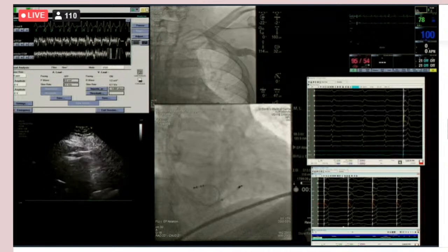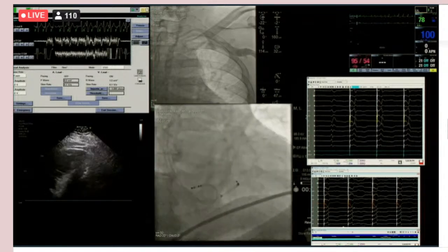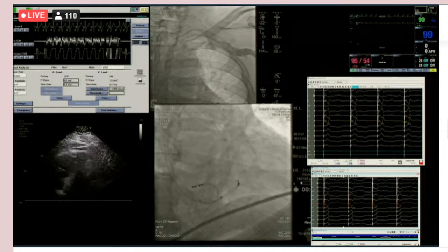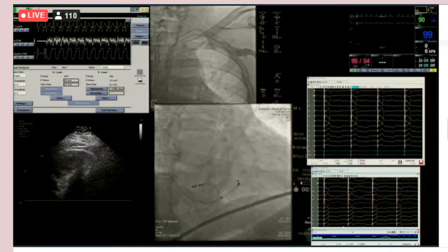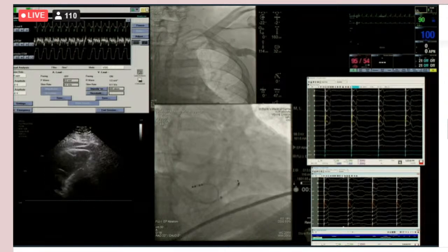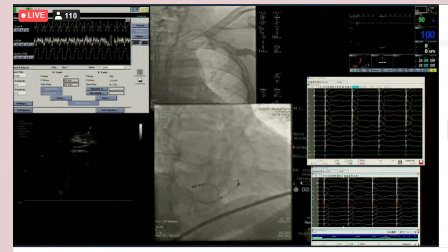Do you do that also or not really? I was planning to see how the R is bigger now. So now the Q is followed by the R, and the R is a little bit bigger than the Q. Can we... 535. Okay, so we're pretty close to where we would want to be on this thing.